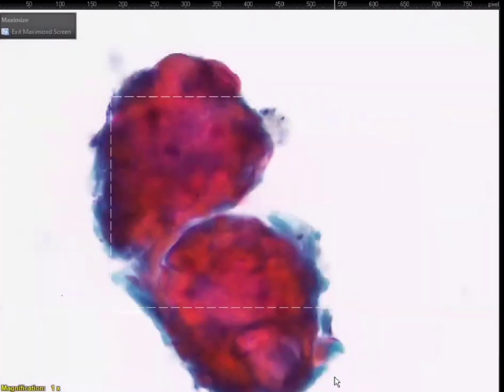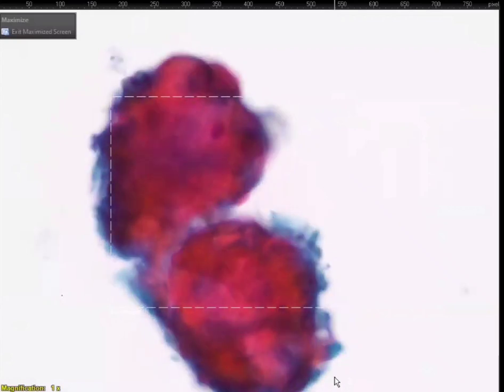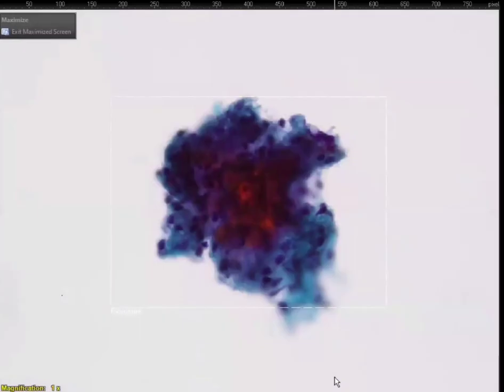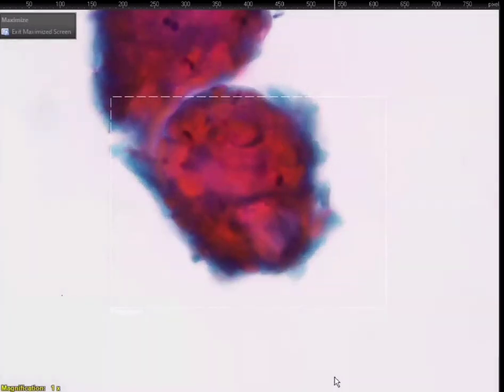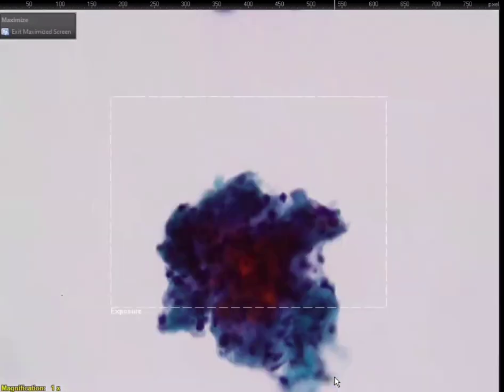Glassy, yes, and this is like keratin debris. Look at that, see? Wow, a 3D chunk of keratin. 3D pearls. Except there's no nuclei. Well, there's a few nuclei, but pearls usually have very little nuclei. Excellent. Okay, so right now, submandibular lymph node.